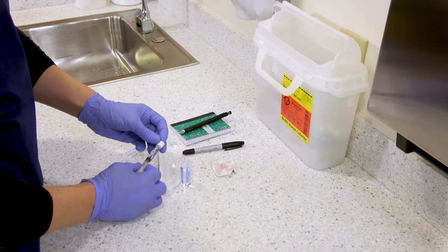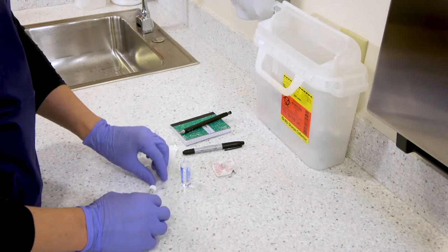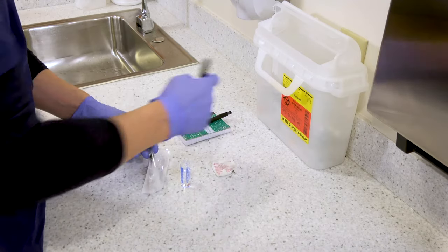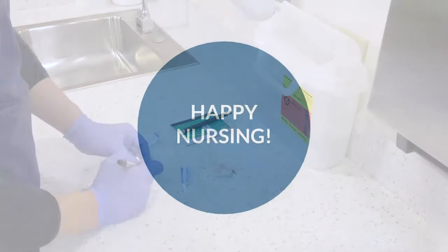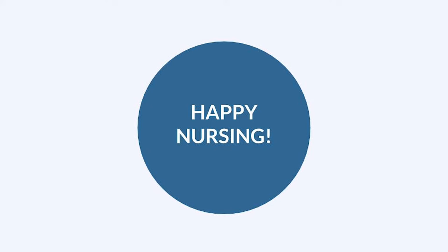As always, if you are not administering this drug right away, you must label the syringe with the drug, the dose, and the date, time, and initial. Make sure that you're following appropriate administration based on the ordered route and of course always follow your five rights. Now go out and be your best selves today, guys, and as always, happy nursing.